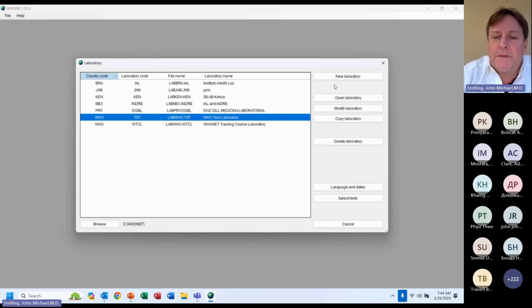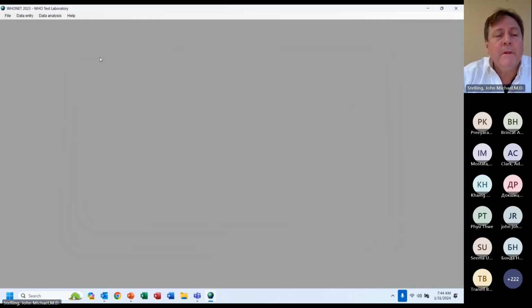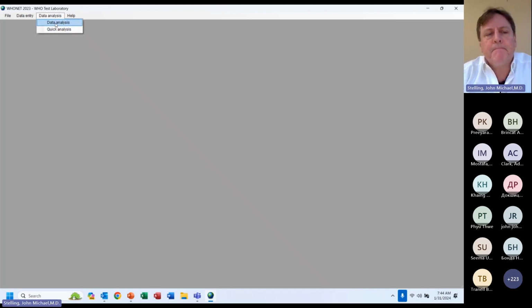So I will choose the WHO test laboratory. I will click on Open Laboratory. I will go to Data Analysis. As I presented in a webinar a few months ago, we have Interactive Data Analysis at the top, followed by Quick Analysis at the bottom. Today, I will focus on the interactive analysis because I want to make all of the decisions about the analysis features. And later, or on part 2, I can talk about quick analysis.